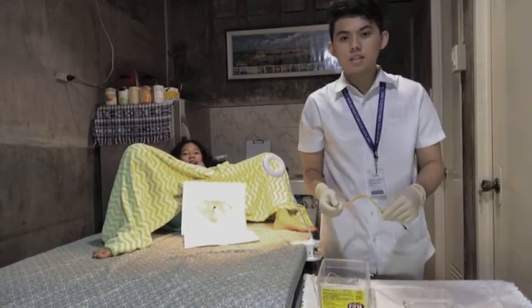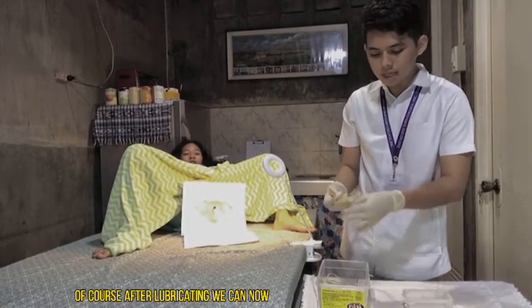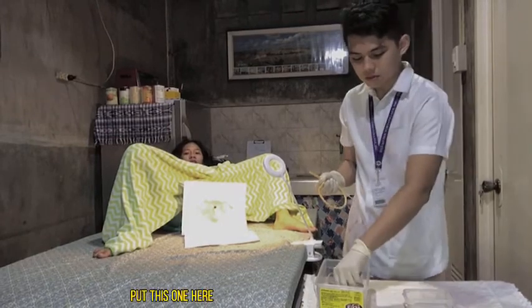Okay, and of course, after lubricating, we can now put this one here.